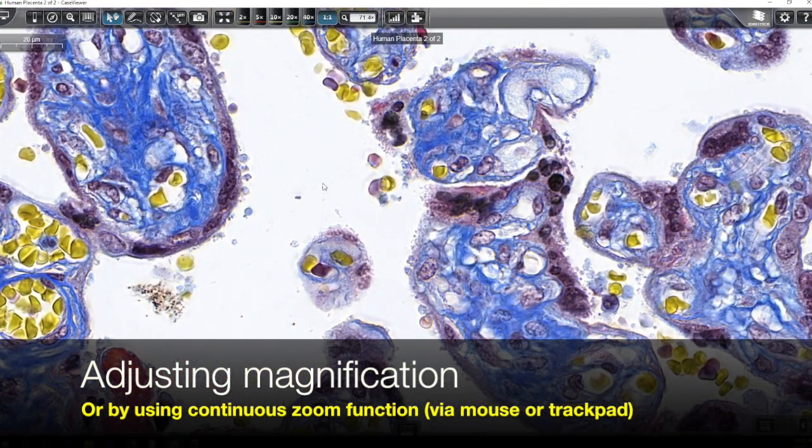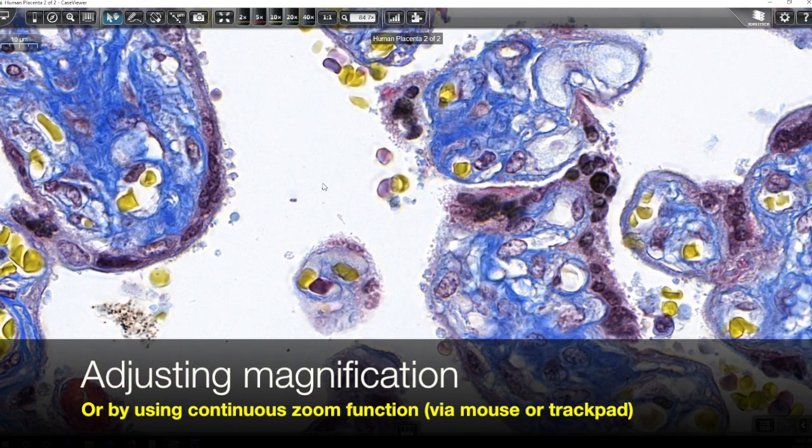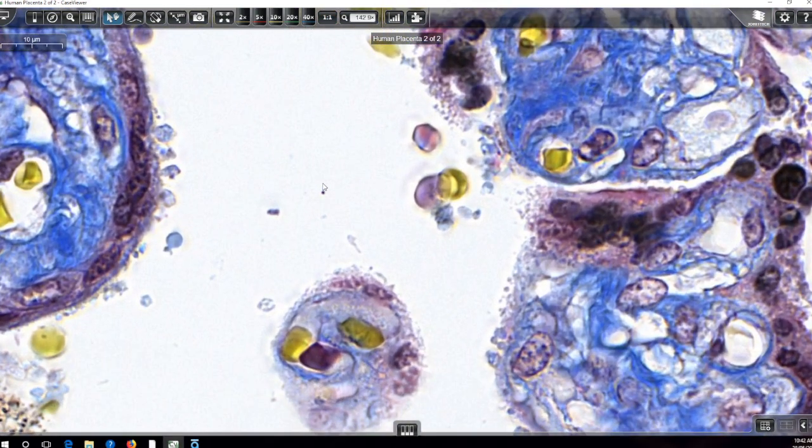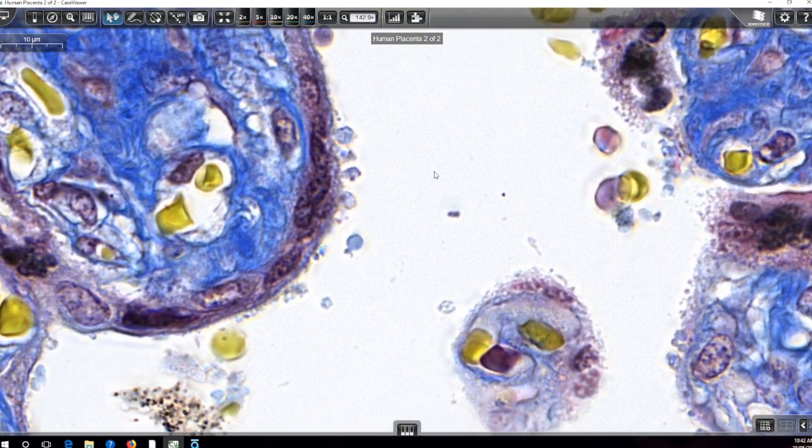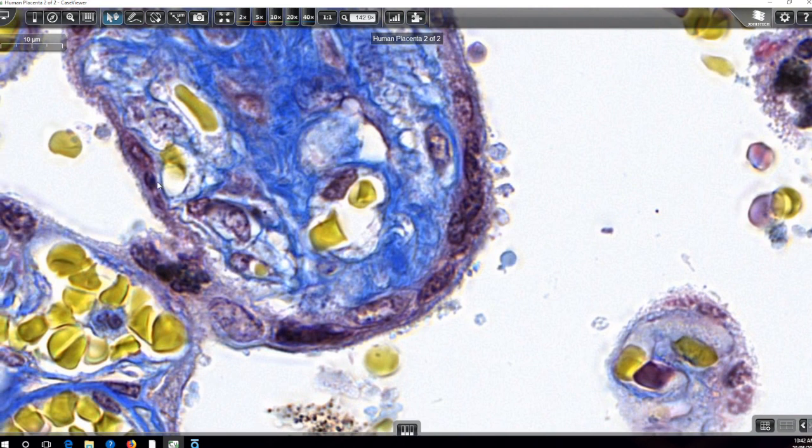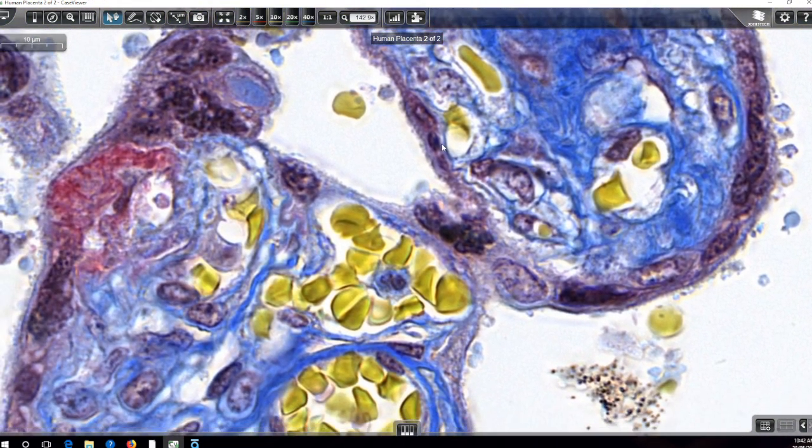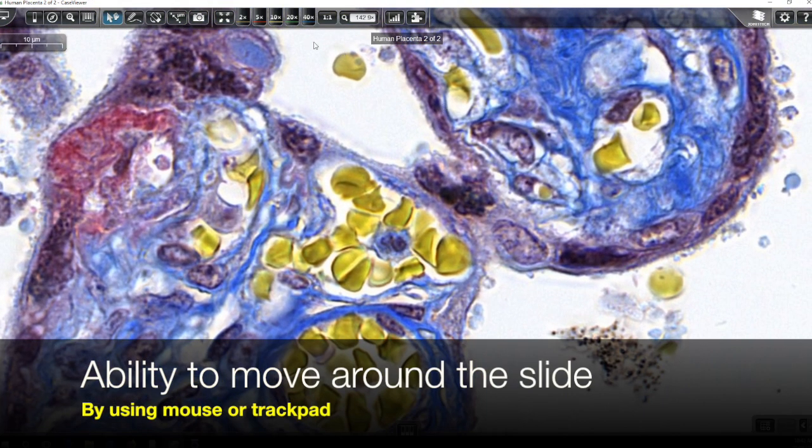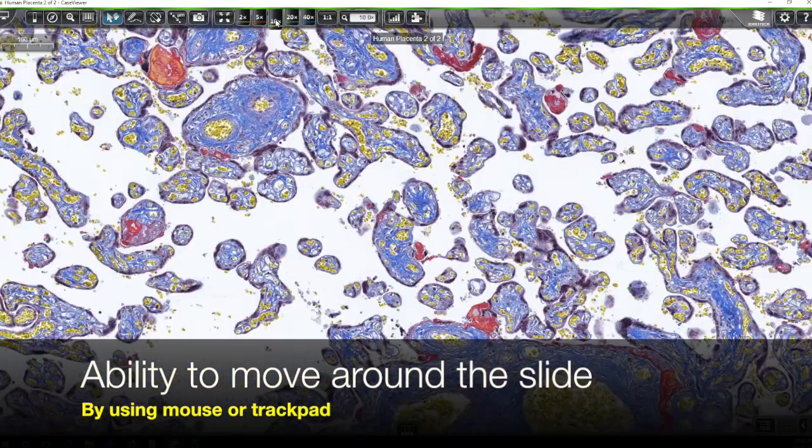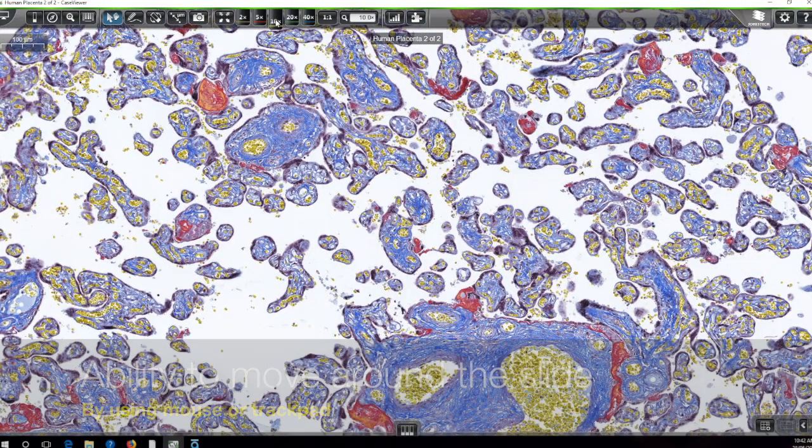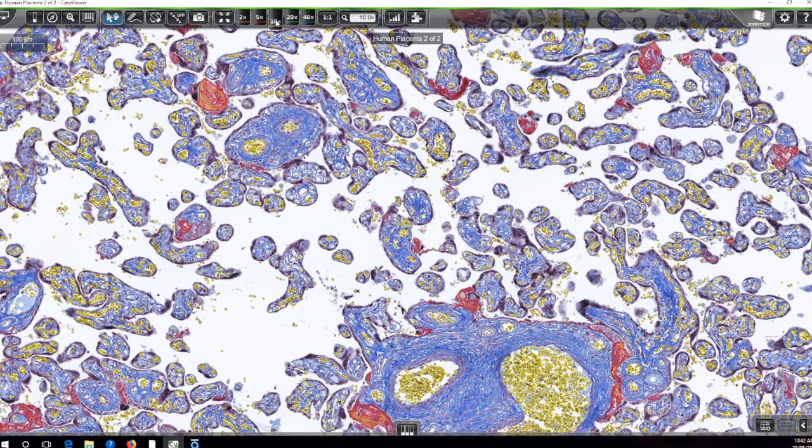The other way to adjust the magnification is just by simply using the mouse to zoom in or out. And there's even a bit of extended magnification beyond what has been achieved using the scanning. We can scroll around using the mouse as well, so it's a really convenient tool for moving around this whole slide.